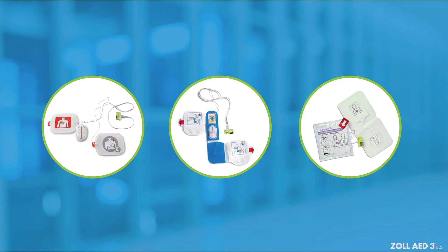The Zoll AED-3BLS can be used with many of Zoll's AED electrode pads, including CPR STAT pads, CPR D pads electrode, and PD pads II pediatric electrodes.